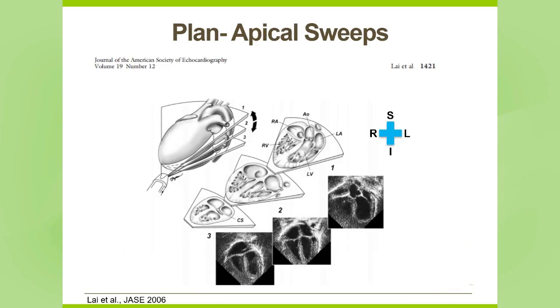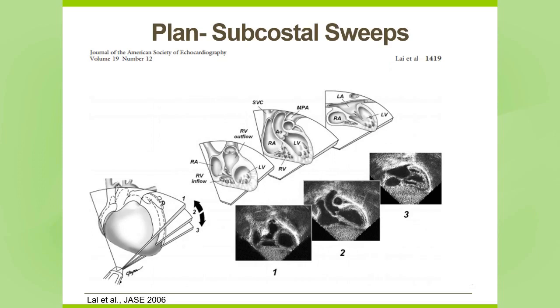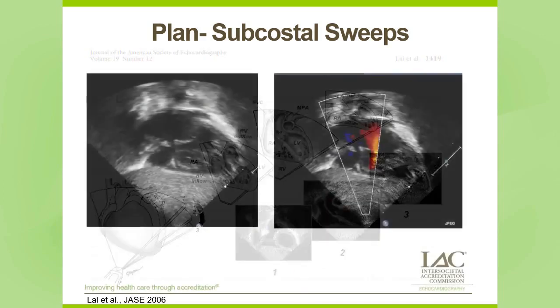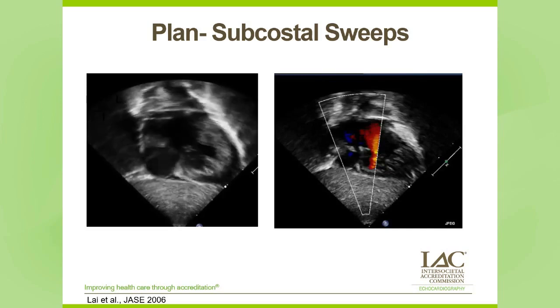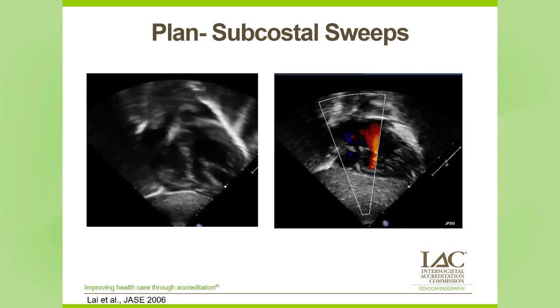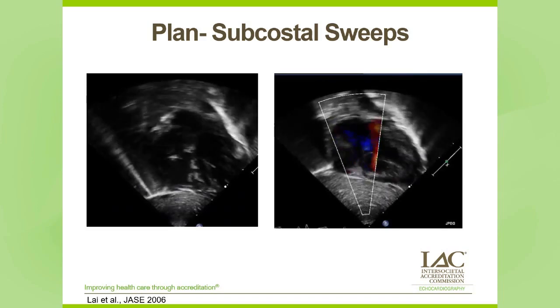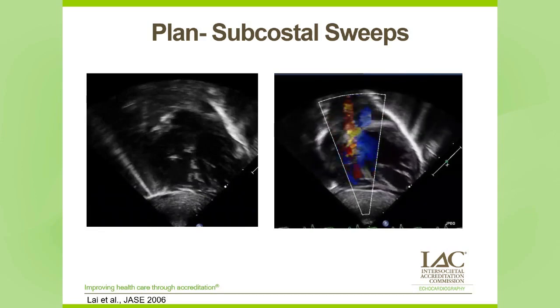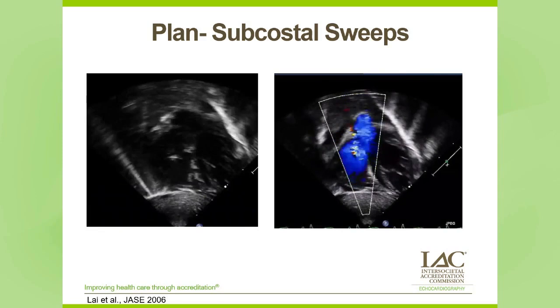In the apical four-chamber view, I superimpose compass points to help describe what we see and where we see it in an abnormal patient. With an apical four-chamber sweep, we often tilt up further to image the RVOT and pulmonary artery. Subcostal sweeps provide great interrogation of the atrial septum, and also allow us to look at the LVOT, RVOT, and pulmonary artery. The subcostal coronal sweep starts with the atrial septum and LVOT, all the way up to the RVOT and pulmonary artery — showing a PFO, color flow Doppler in the SVC, a VSD, and the RVOT.